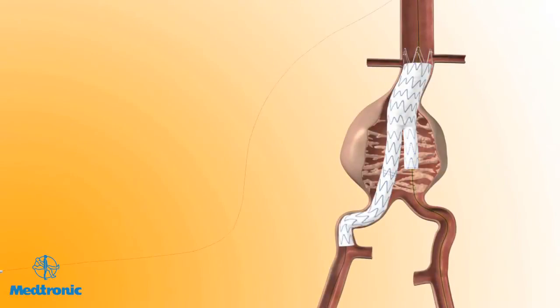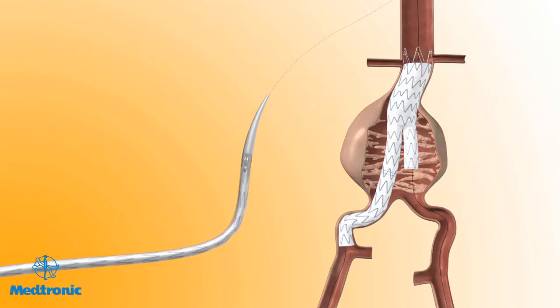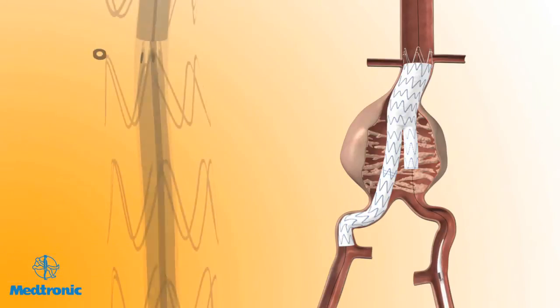On the patient's contralateral side, insert a guide wire through the contralateral stub leg and the aortic neck portion of the previously placed bifurcated stent graft. Place the Endurant iliac delivery system containing a contralateral limb over the guide wire. Wet the graft cover to activate the hydrophilic coating. Insert the delivery system into the vasculature and through the contralateral stub leg of the bifurcated stent graft.